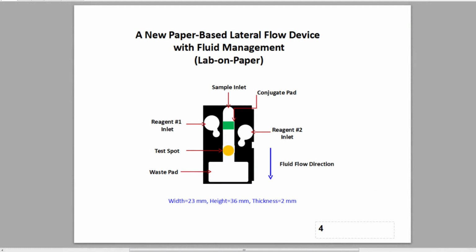The lateral flow device I will present today combines the ease of use and low cost of these paper-based test strips, but can manipulate several reagents so that, like the polymer-based systems, it can run more complex assays autonomously.